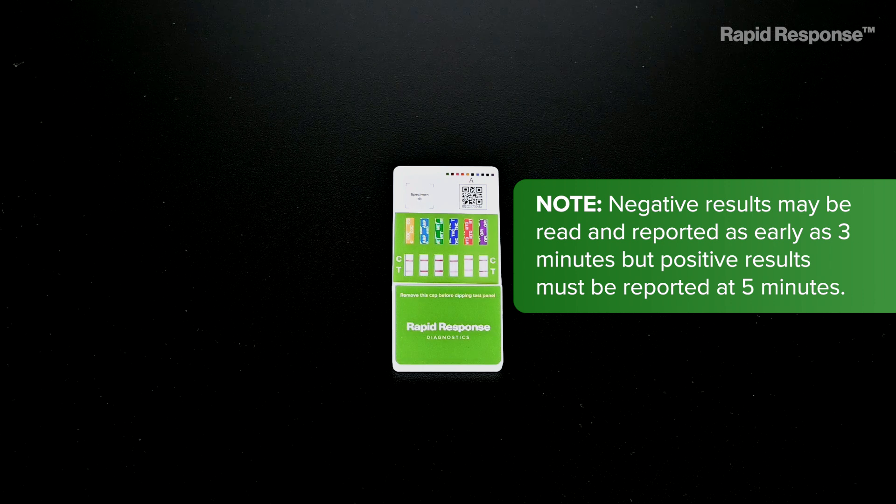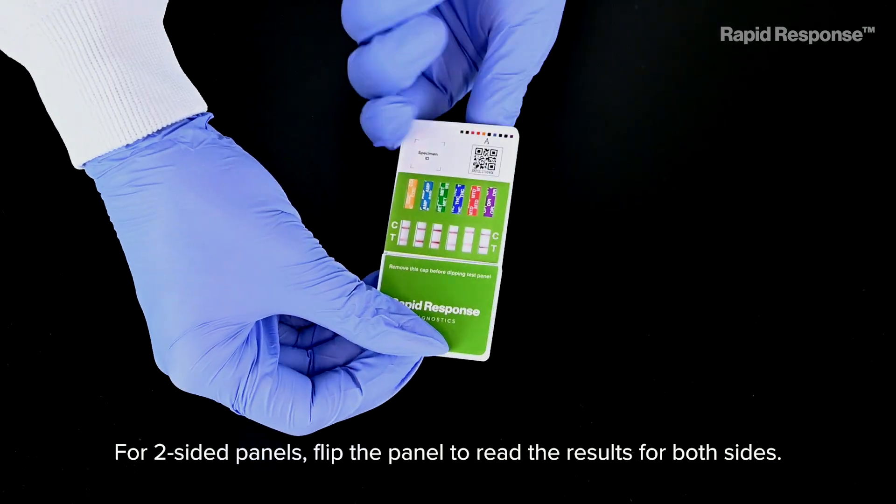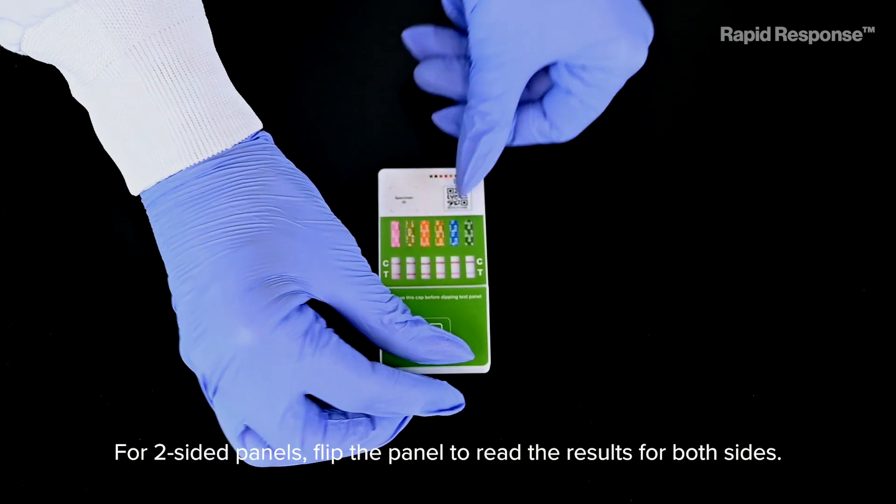Note: negative results may be read and reported as early as 3 minutes, but positive results must be reported at 5 minutes. For two-sided panels, flip the panel to read the results for both sides.